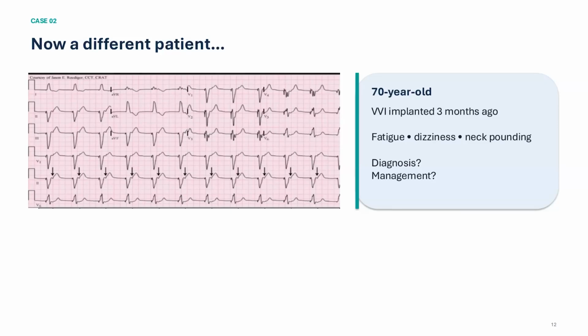Anyone think otherwise? This is not a spike. I think this is the mark in between the leads. This arrow, I think, indicates retrograde P. Yes, retrograde P after the paced beat. Yes, I think there is retrograde P. This may trigger pacemaker problems.